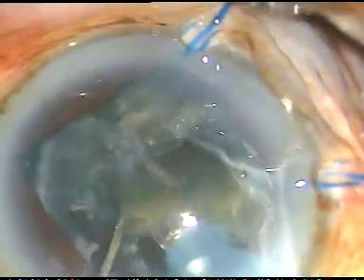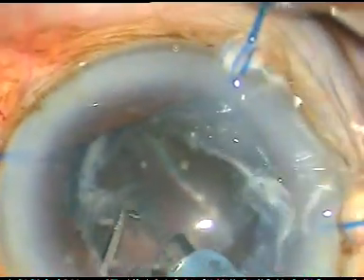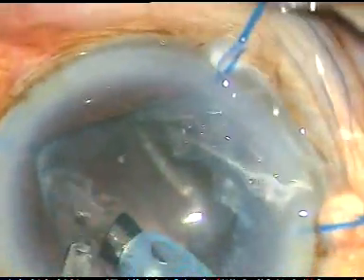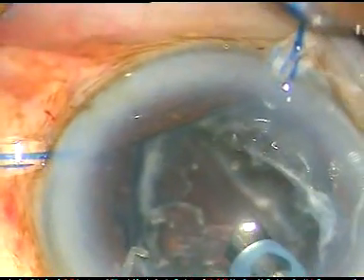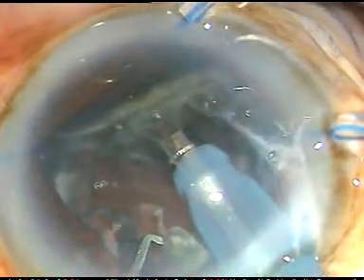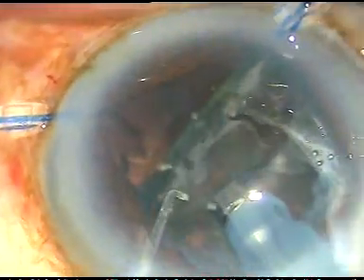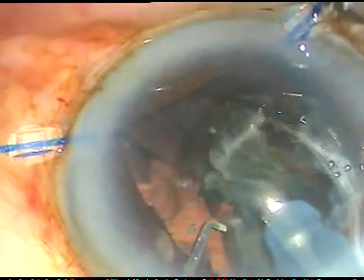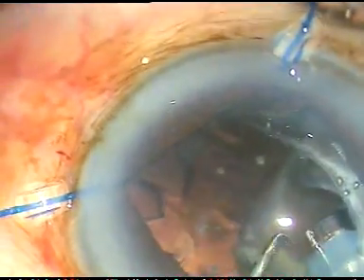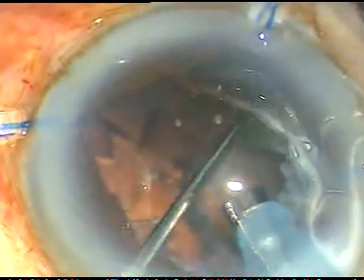Thus I protect the posterior capsule, and when the nucleus is removed, I go to epinucleus mode and gently pull the epinucleus. I am keeping an eye on the posterior capsule, how far it is. I can see that it is quite far. This is the last nuclear piece and this is the last part of the epinucleus.